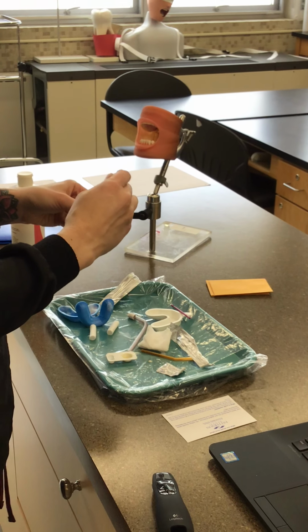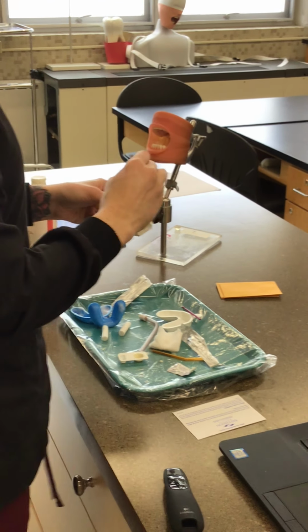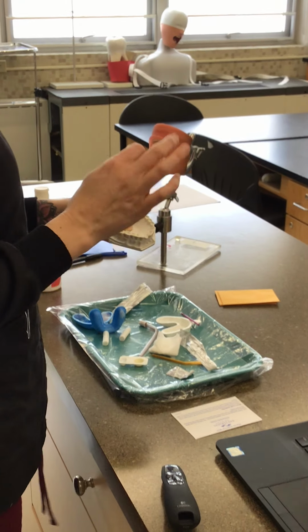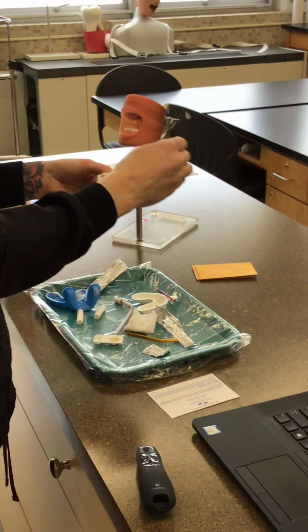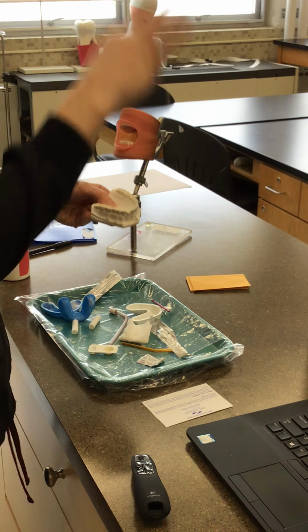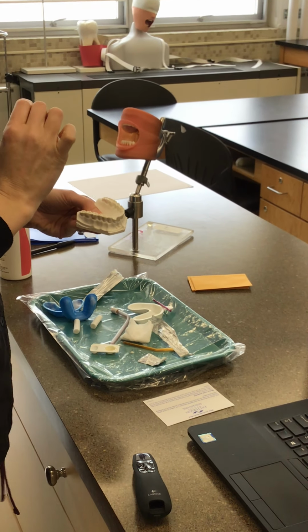So then you go in, but in real life, when you have a 2-year-old sitting there, you're not gonna wanna spend 1 to 3 minutes nicely making sure all of the teeth are covered. You're gonna wanna utilize the fact that it flows. Okay, and you're gonna wanna do that buccal, lingual, okay, and then a quick swipe, direct buccal, direct lingual, and you're good, getting it all on there, okay?